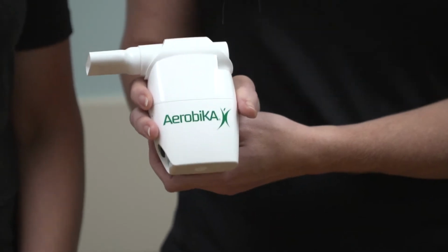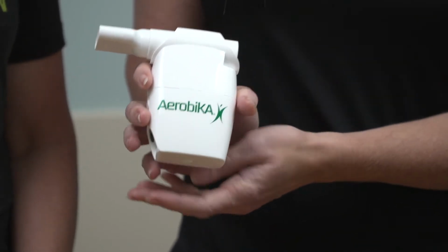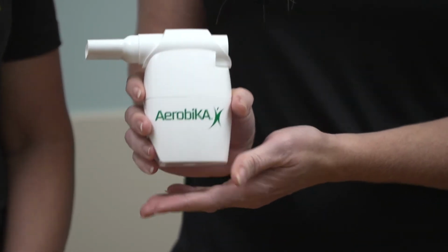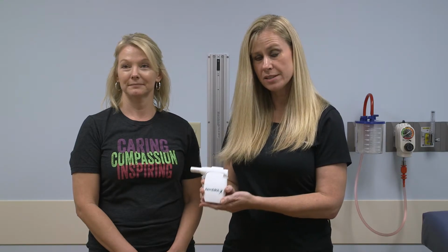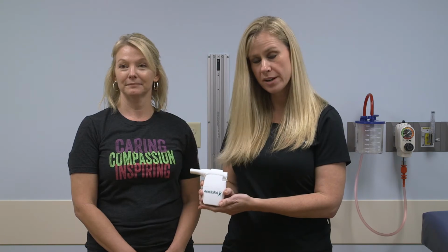And now we're going to talk about the Aerobika. The Aerobika is an oscillating PEP device. It is a great portable modality, but it is very patient effort dependent. So I always tell my patients what you put into this is what you're going to get out of it. So if you put poor effort into it, you're going to get poor effort out of it.